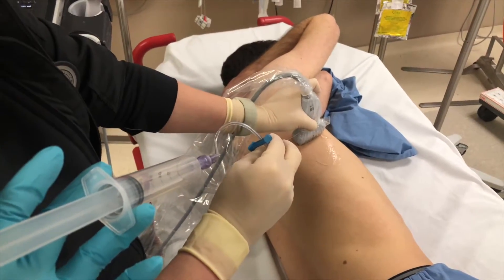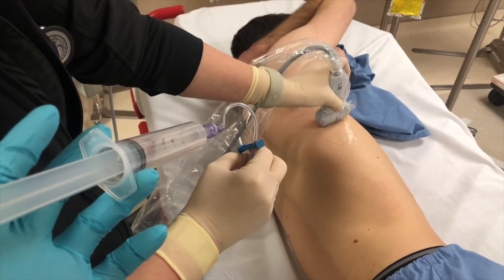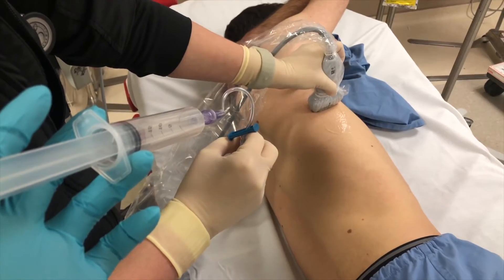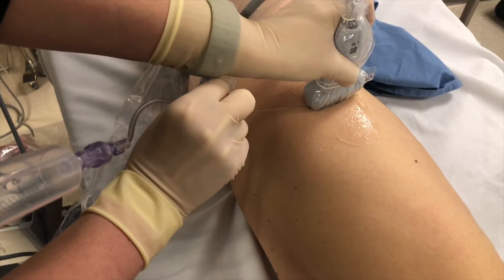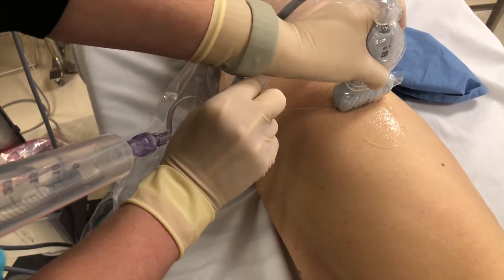Your patient can be supine or in lateral decubitus position. Here we'll demonstrate the lateral decubitus approach. Position the probe lateral to the nipple between the 4th and 5th ribs at the mid-axillary line in transverse orientation. Use the in-plane technique, staying relatively shallow with respect to the skin as you begin. An assistant is helpful to inject the anesthetic once you're in position.